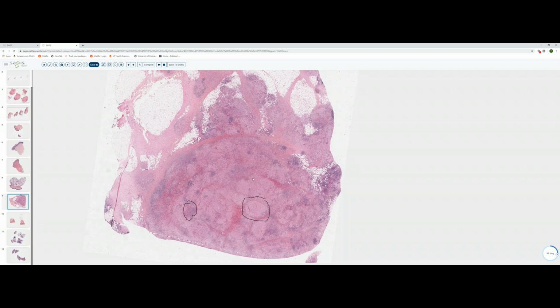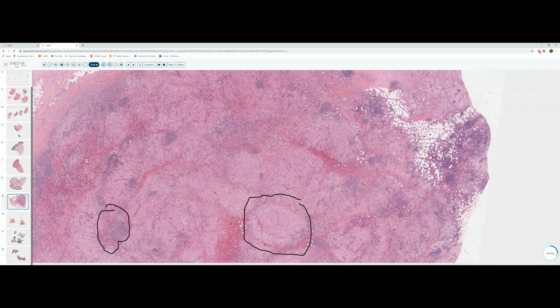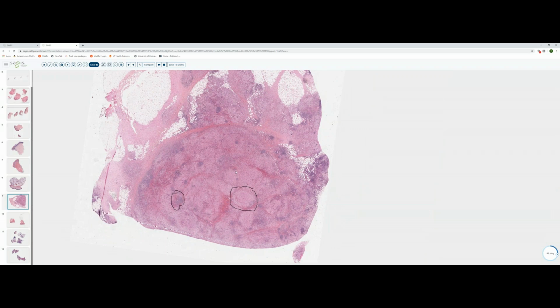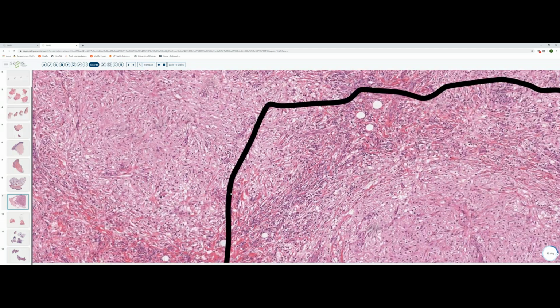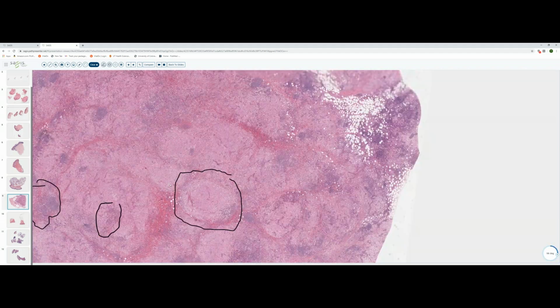Most commonly, this presents with massive cervical lymphadenopathy and fever, but there are a small percentage of patients who will have extranodal disease, and an even smaller percentage who will have cutaneous involvement only. But what's characteristic, it's kind of a non-X or non-Langerhans cell form of histiocytosis. But almost all instances have aggregates of lymphocytes and plasma cells, and then these large nodular aggregates of clear staining cells with evidence of emperipolesis. So Rosai-Dorfman disease.